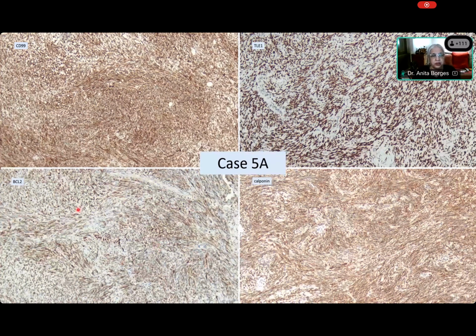All right, here is BCL2. Is it positive or negative? Positive, ma'am. Right. What is it? Nuclear or cytoplasmic? No, it's not. BCL2 is never nuclear. Cytoplasm. And calponin? Also cytoplasm. Cytoplasmic. Yes. So the only thing that is crisp and has taken on the shape of the nucleus is TLE1, because it is nuclear positivity.